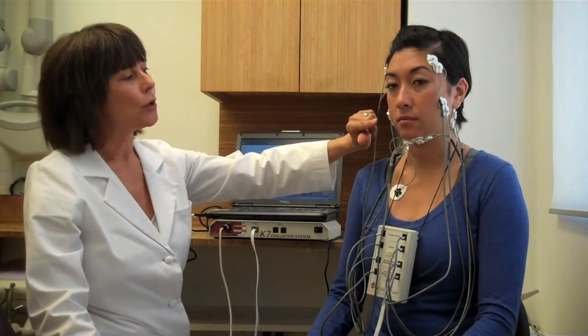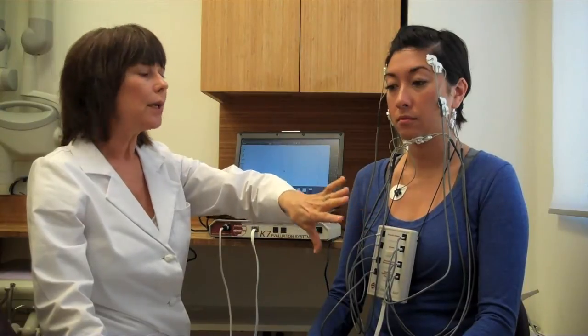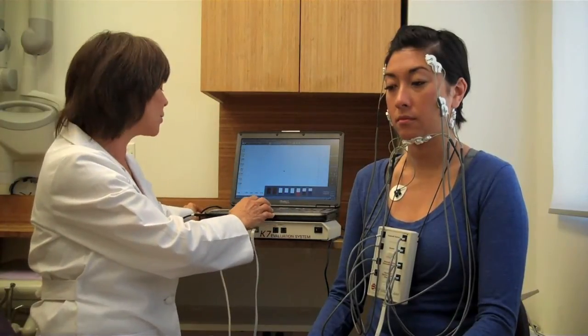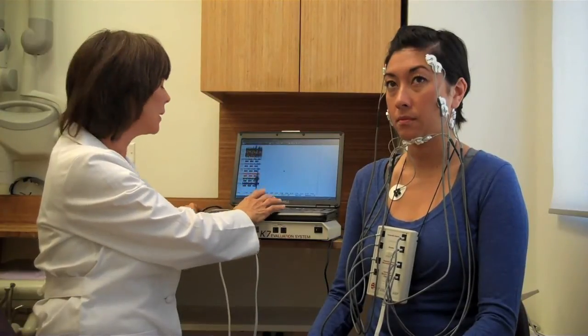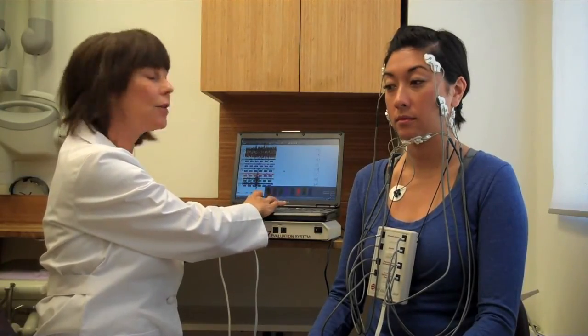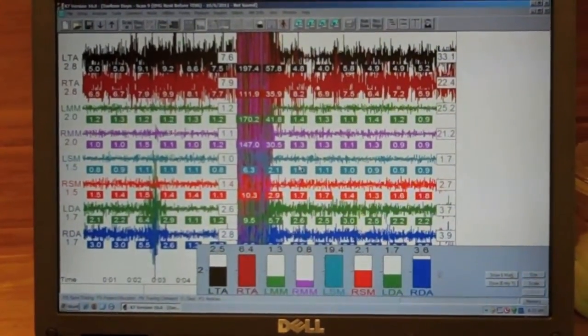We have electrodes placed on various muscles on our patient, and these muscles relate to how the jaw moves. We're measuring her muscles right now, and if we look at the computer we can see what her muscles are doing. We take a scan with her jaw hanging open, and then have her grit her teeth together and take another scan.